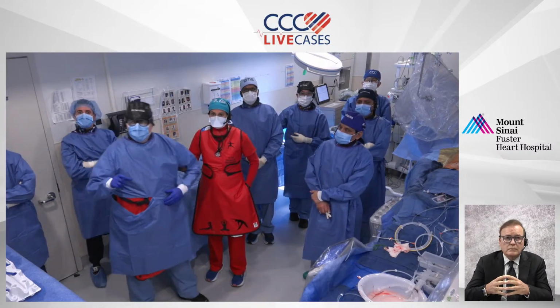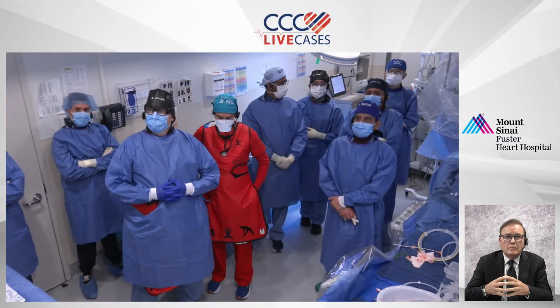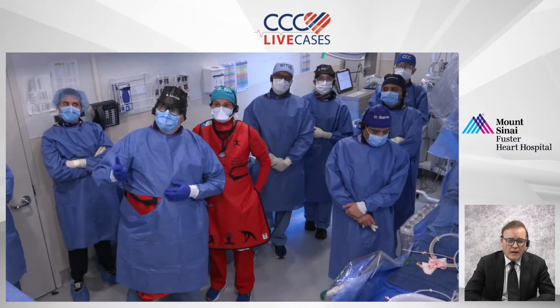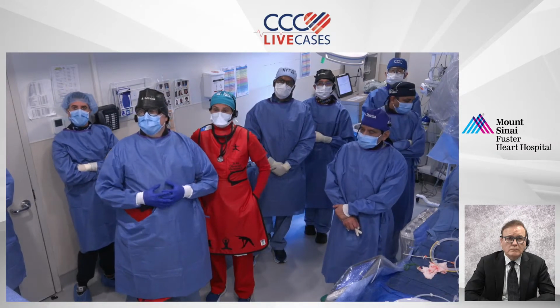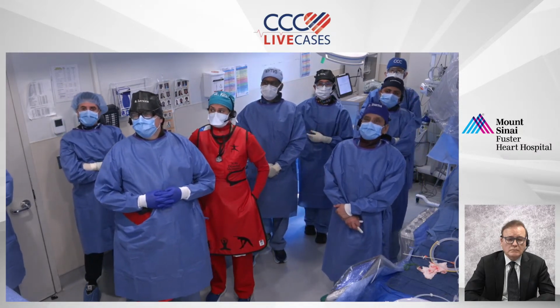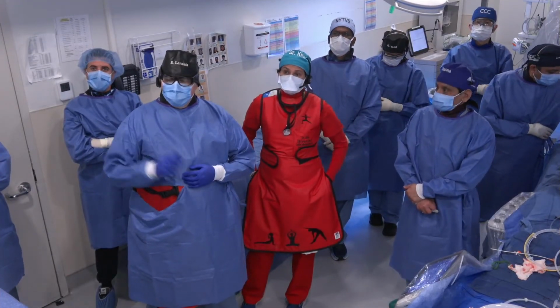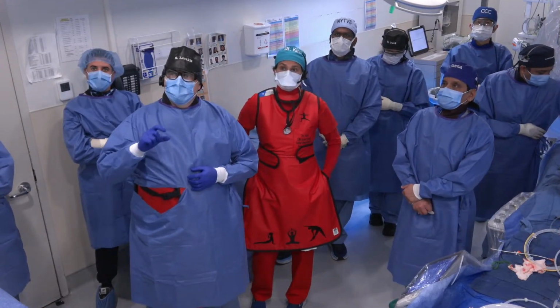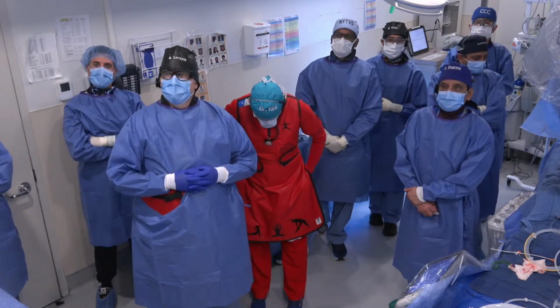Compare the areas of the PVL to the frame of the valve. So that's the criteria. Of course, this can be very difficult, so you have to put it all together, and we can measure pressure half time too, so there are many criteria. But the easiest criterion is the short axis view, comparing the frame of the valve and measuring the perimeter of the PVL.